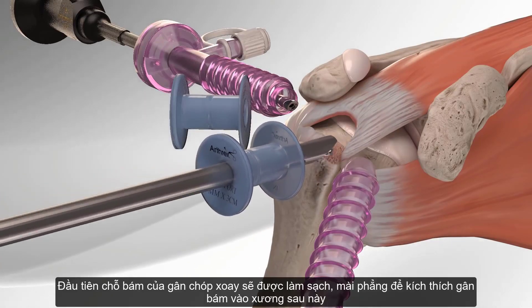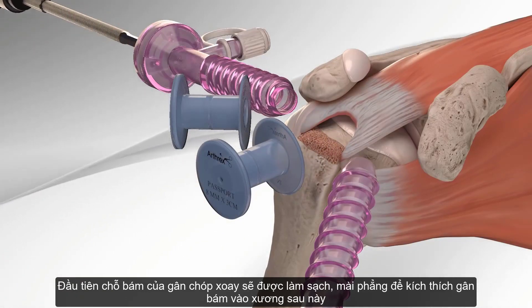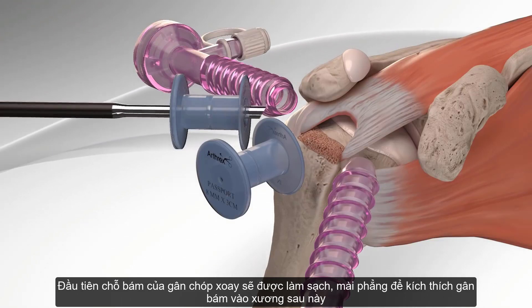First, the surgeon prepares the rotator cuff and humerus for the insertion of the first bone anchor, called a swivel lock, by punching a bone socket.